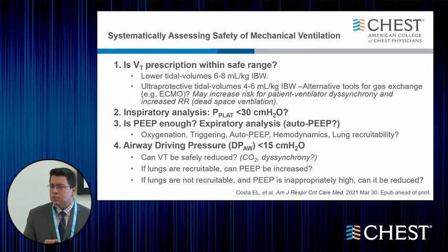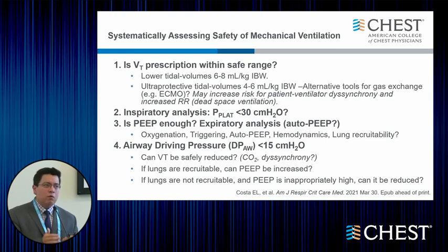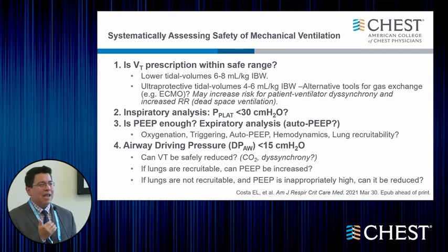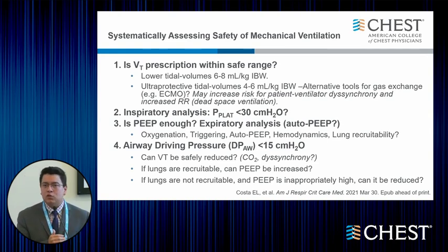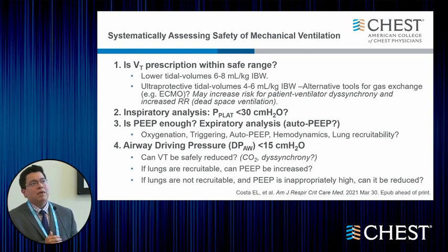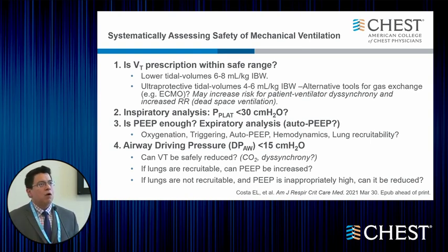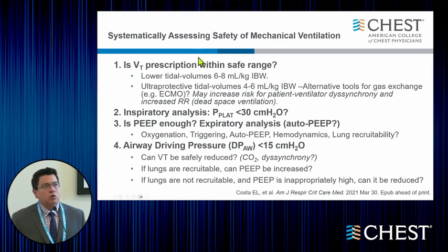It's also important to keep in mind a very algorithmic approach to identify, especially in these questions or at the bedside, whether mechanical ventilation is actually lung protective or not. We can start with a tidal volume prescription, and we can ask whether this is safe or not. Again, we discussed that usually we think of a lower tidal volume strategy, 6 to 8 mL per kilo.